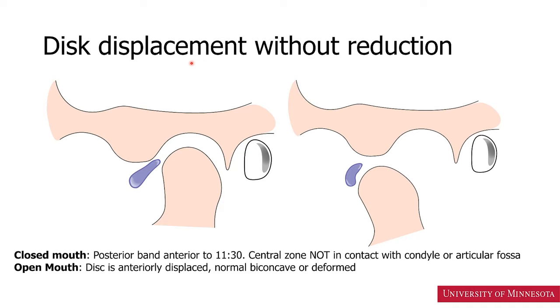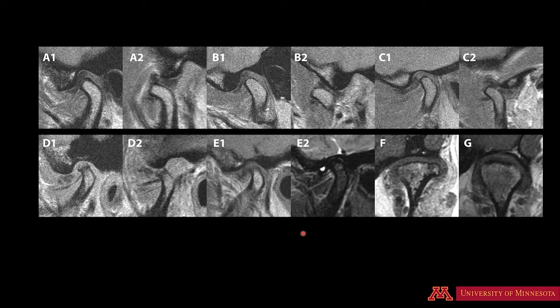In case of disc displacement without reduction, the disc is anteriorly displaced. The disc could have a normal biconcave shape or could be deformed. It could be anteriorly located in front of the condyle, in front of the articular eminence, or in front of the articular fossa. Let's review this MRI series to see different relationships.